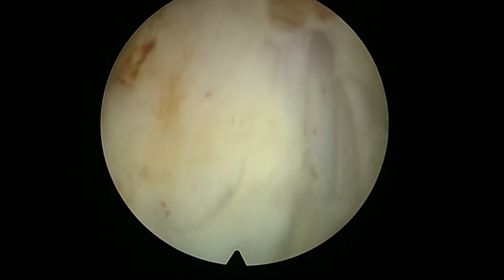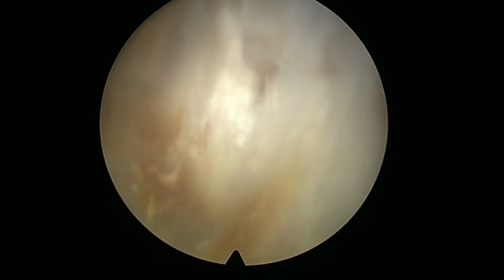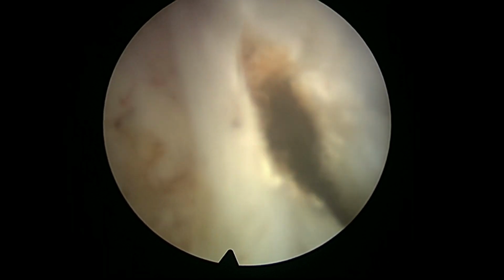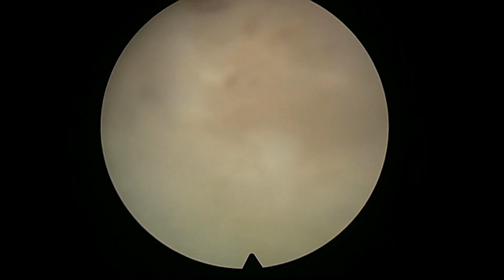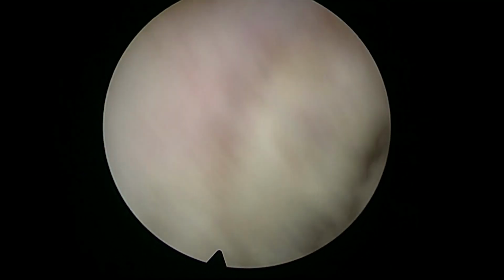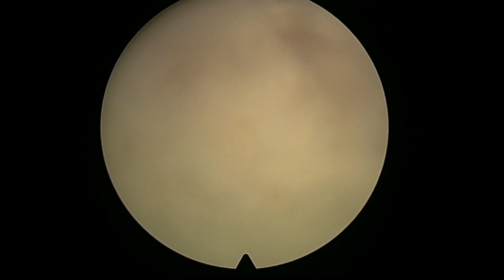Often what I do is, if I feel that the tissue is very hard, I will enucleate the adenoma en bloc, but I will not cut the 6 o'clock attachment at the bladder neck. And then I will resect the tissue. Of course, having a pedicle that fixes it to the bladder neck makes things much easier. And so I think I have often regretted trying morcellation in cases like this, although in this case I think it was successful. So take it into account. If you see that the tissue is very, very hard, maybe it's better to do a resection instead of morcellation at the end. Of course, this tissue is totally devascularized and there will be no bleeding, so you can resect quite safely.